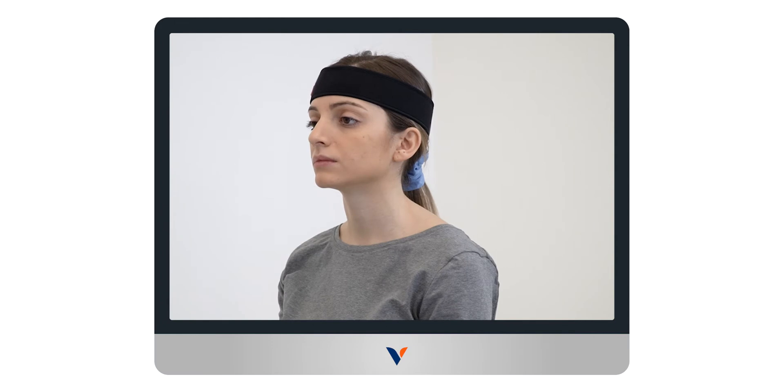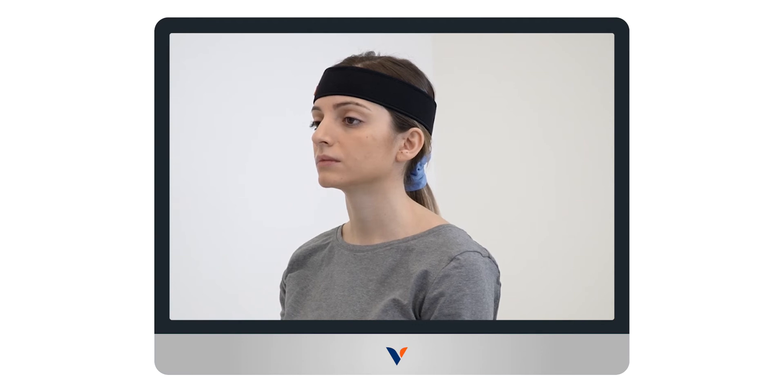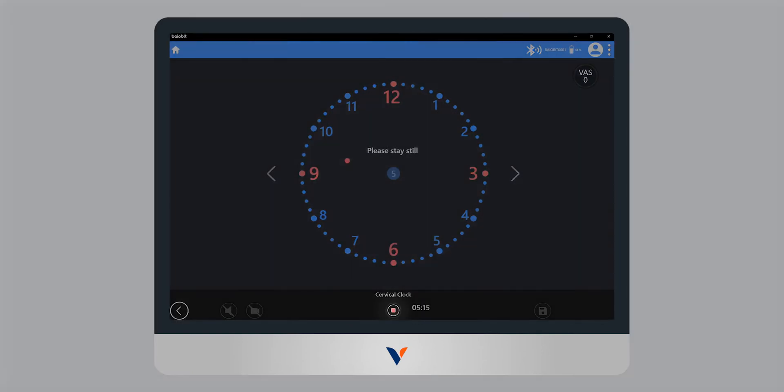The test begins with the patient sitting still in a neutral position with his head in front of the screen and the face in the center of the clock ring visible on the screen. Start the acquisition by clicking on REC.